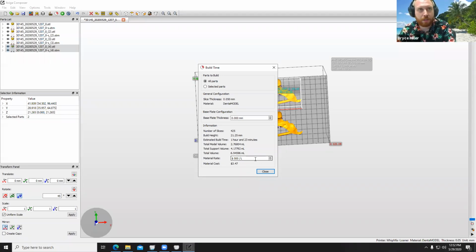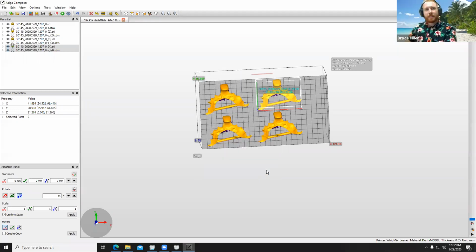Post processing's minimal. You snap off the supports, do your cure. If you want to add any pink, if you're using something like Triad, it's a couple of minutes to veneer some pink on there. It's almost no time. So it's a super low cost manufacturing process, which is just awesome. Affordable direct manufacturing almost. Yes, one could say.